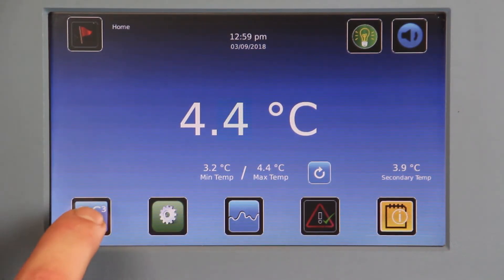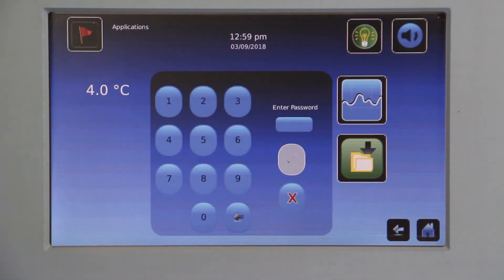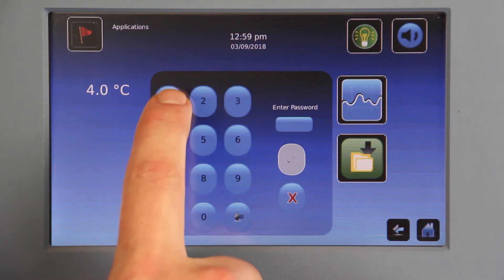Touch IC3 apps and then the settings icon, which looks like a gear. Enter the user password. The default is 1234.